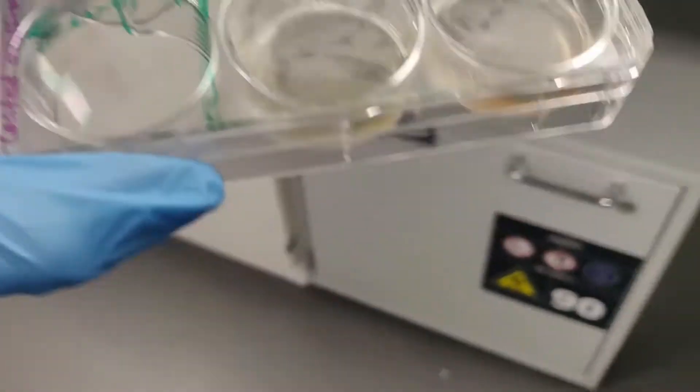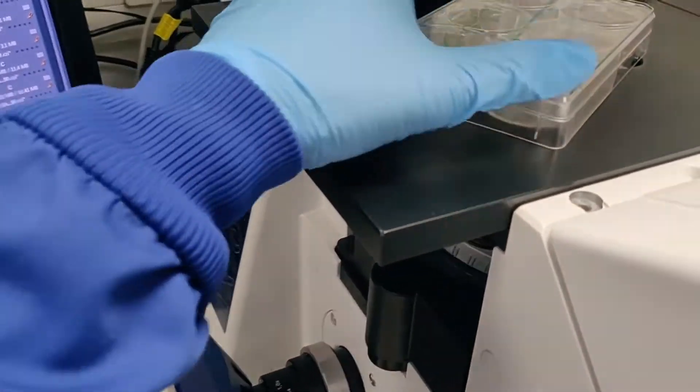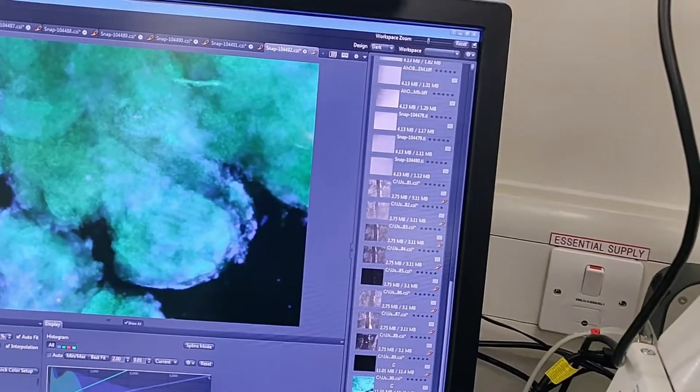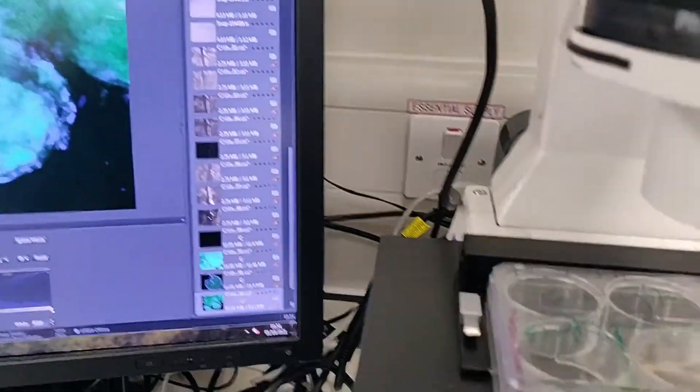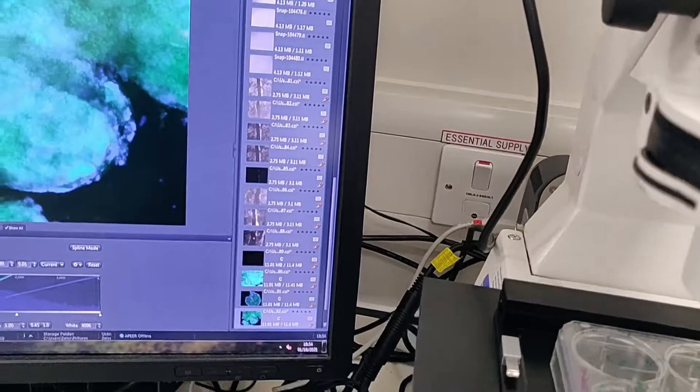And in the media, there is a substance that is called phenol red. And this phenol red changes from red to yellow when the pH decreases. So when the media becomes yellow very quickly, like in one day, we assume that there is some kind of contamination. So when the medium is cloudy and yellow, it's safe to assume that there is a contamination.